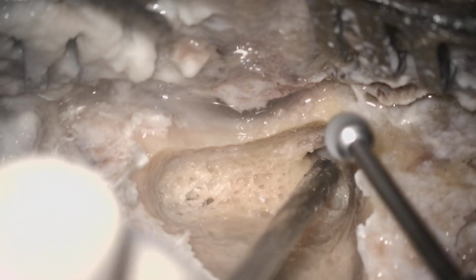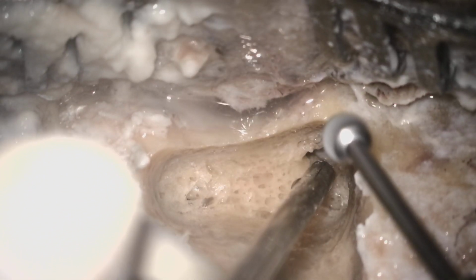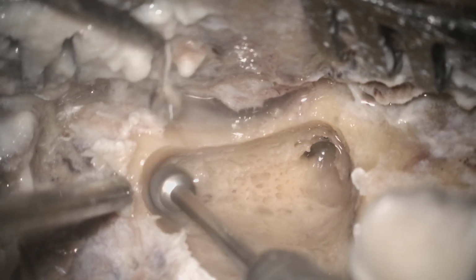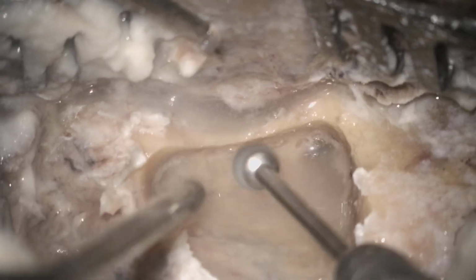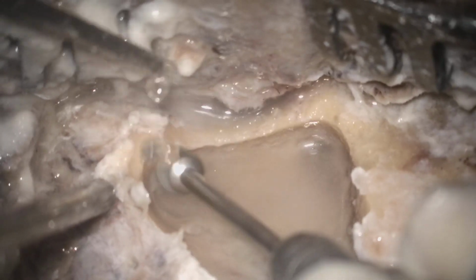Then two landmarks are very important. First is the lateral semicircular canal, second is the digastric ridge, and the third one is the incus. I will show how you have to identify the incus and what is the role of the incus in delineation of the facial nerve in the mastoid cavity. So first we have to drill all the bones from the tip cell area.